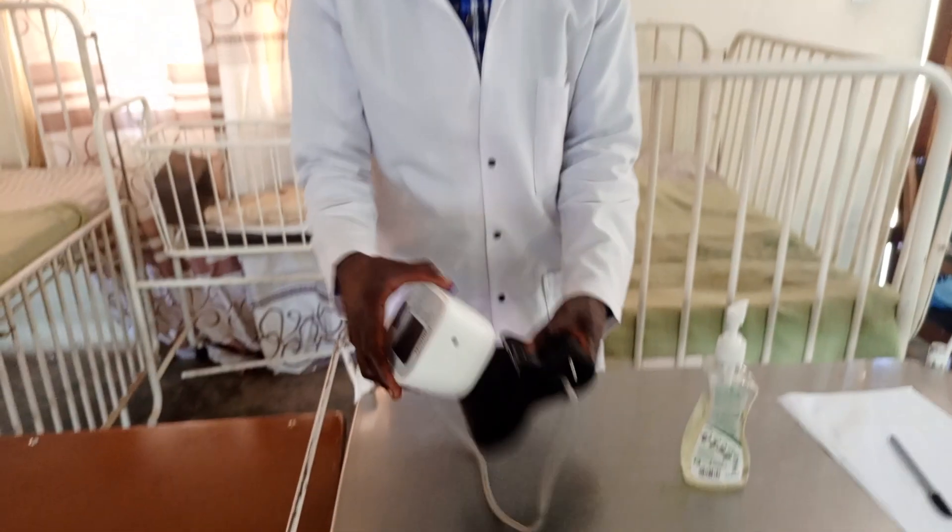Good afternoon, welcome to our YouTube channel. This afternoon I'm going to demonstrate how to check blood pressure using the automatic BP machine.